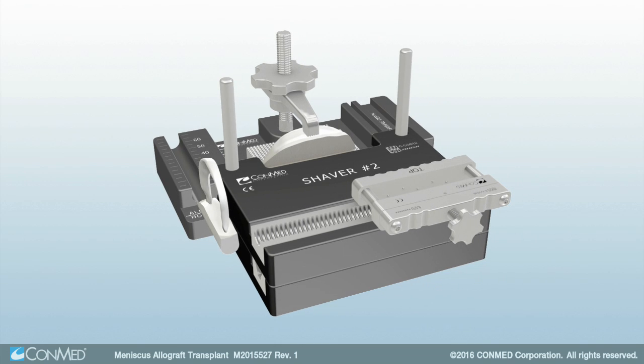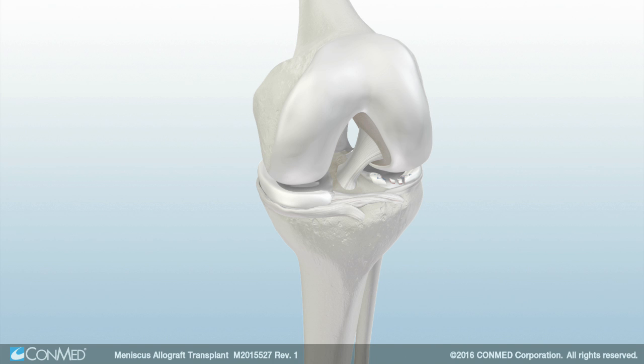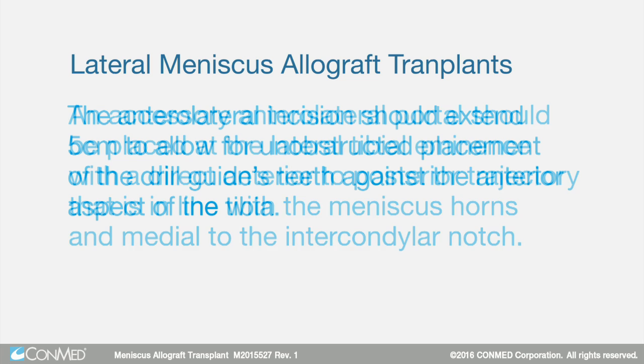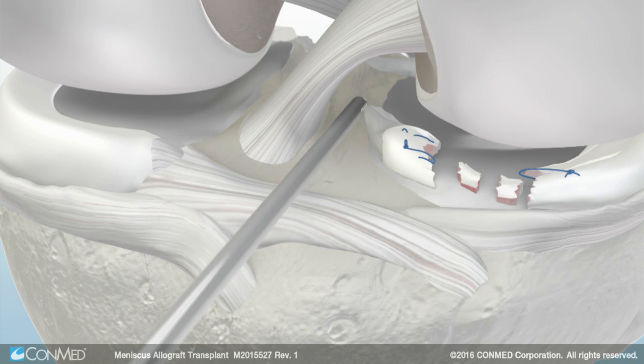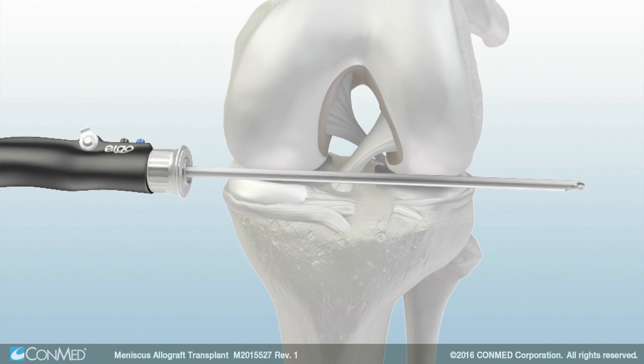A rongeur can be used to trim up to 5 mm of remaining bone posterior to the posterior horn attachment site. To prepare the recipient tunnel, use anteromedial and anterolateral portals for visualization of the damaged meniscus. For lateral meniscus allograft transplants, an accessory anterolateral portal should be placed at the lateral tibial eminence with a direct anterior to posterior trajectory in line with the meniscus horns and medial to the lateral intercondylar notch. The anterolateral incision should extend 5 cm to allow for unobstructed placement of the drill guide's teeth against the anterior aspect of the tibia. Then remove the fat pad to aid in visualization and remove the damaged meniscus. Perform a notchplasty to aid in approach.